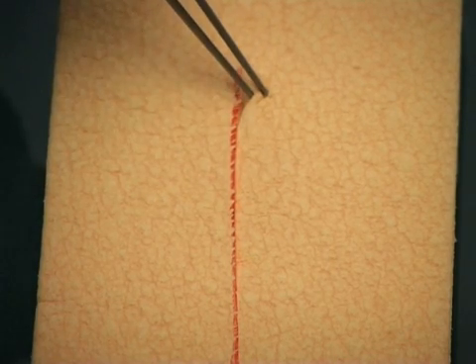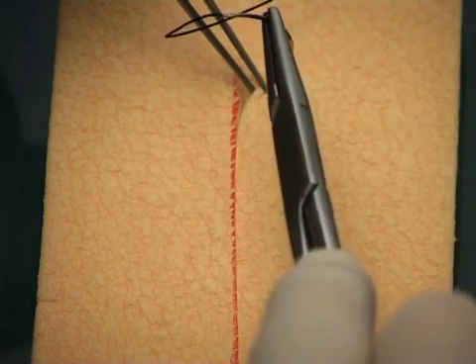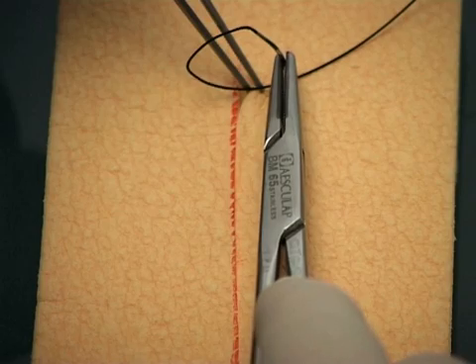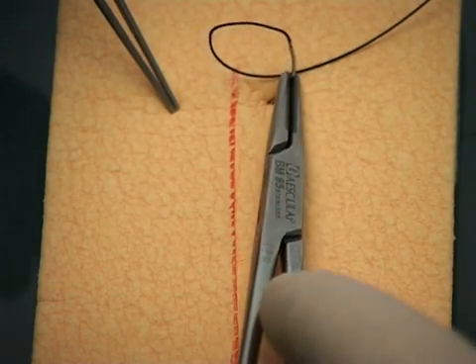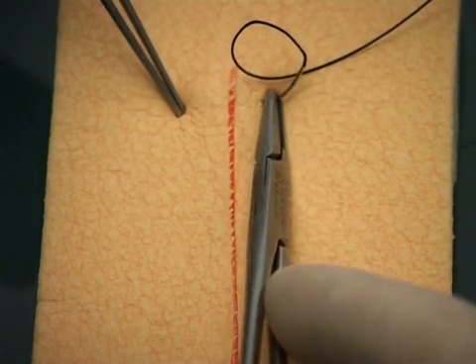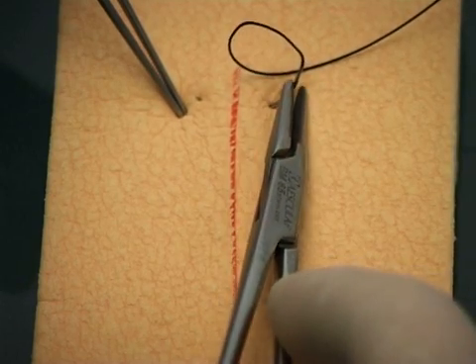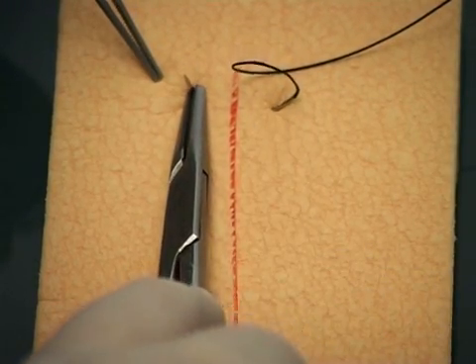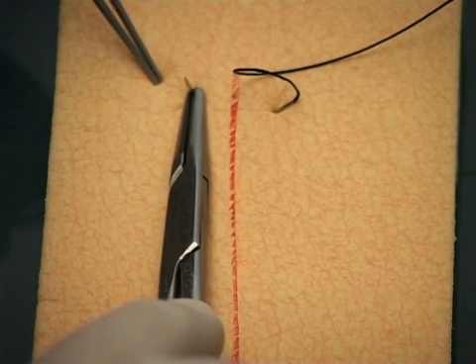The point of the needle enters the skin at right angles, at an appropriate distance from the wound edge. This would depend on your needle size and the tissues you are suturing. Drive the needle through by a rotatory movement of the needle holder, recreating the arc of a circle.